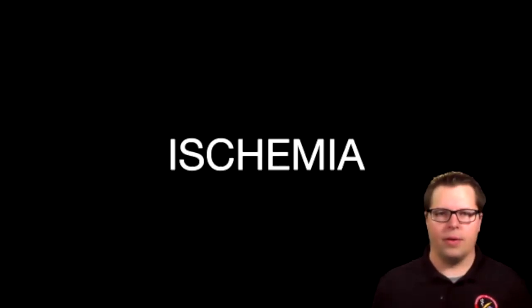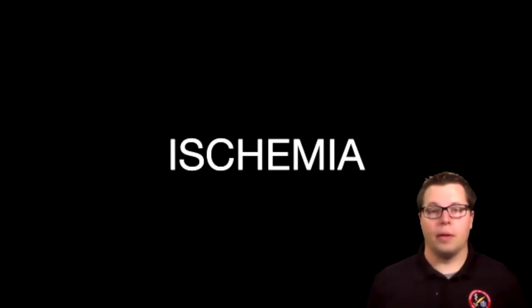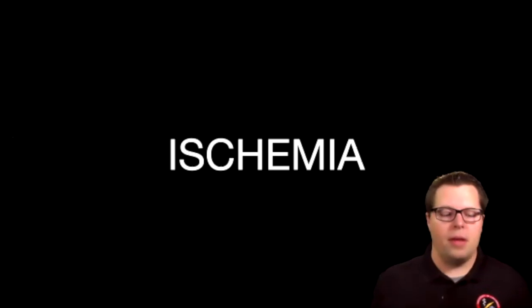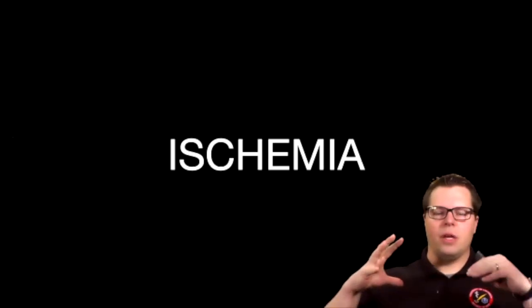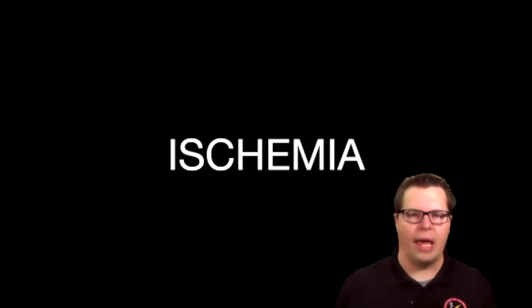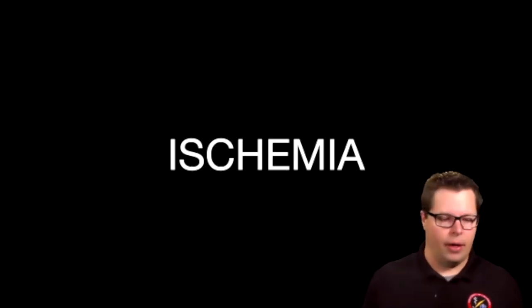Moving on from there. I mentioned all this already. Moving on. All right. Rate, rhythm, axis, intervals, and then let's look at ischemia. What does ischemia look like? Ischemia is different from infarct. Important to kind of note that. Ischemia means the heart is not getting enough blood supply, or that it's under more strain than it is used to handling. It is a lack of sufficient blood flow, but not no blood flow. It's not dying tissues, it's hurting tissues, if you want to call it that.